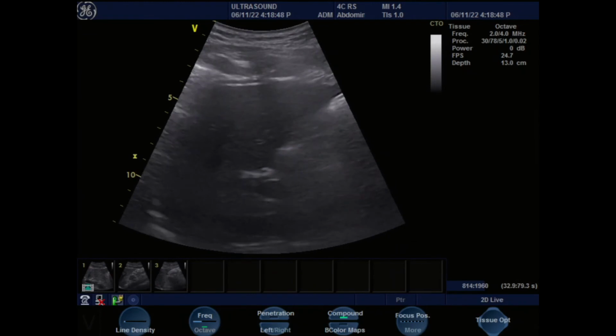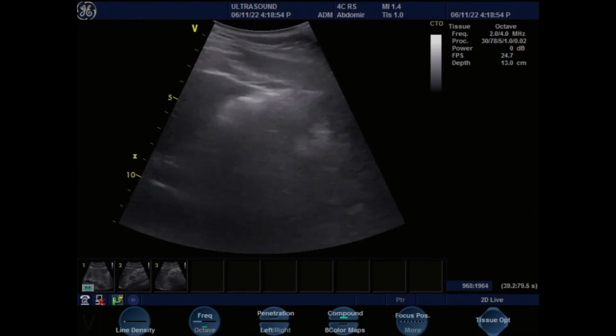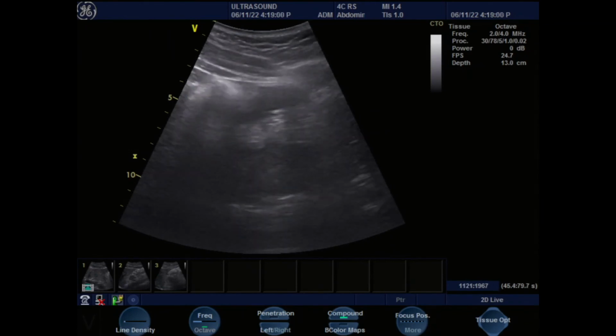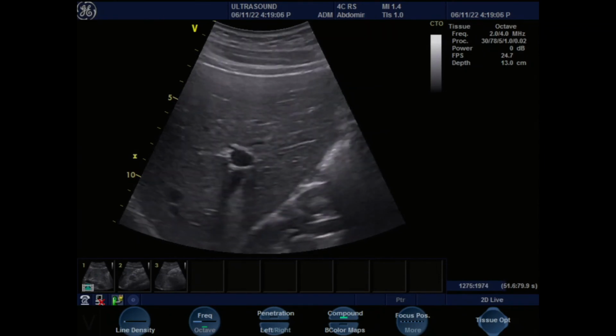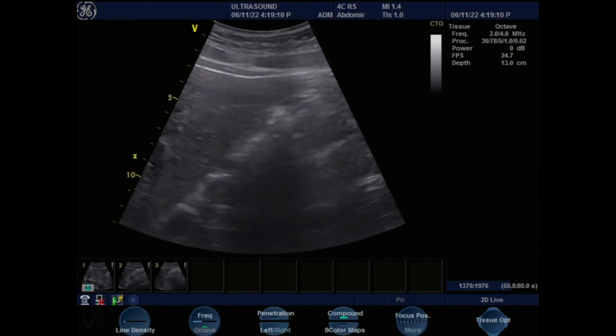If you have the patient take a deep breath, you'll know that with deep inspiration, the diaphragm pushes the organs down. So move your probe down and have it ready for where the organ that you need to scan will come down. So now we send a really deep breath and hold. Deep breath in, beautiful. See, there it is, beautiful. So find it again. No, you have it, it's not going anywhere.